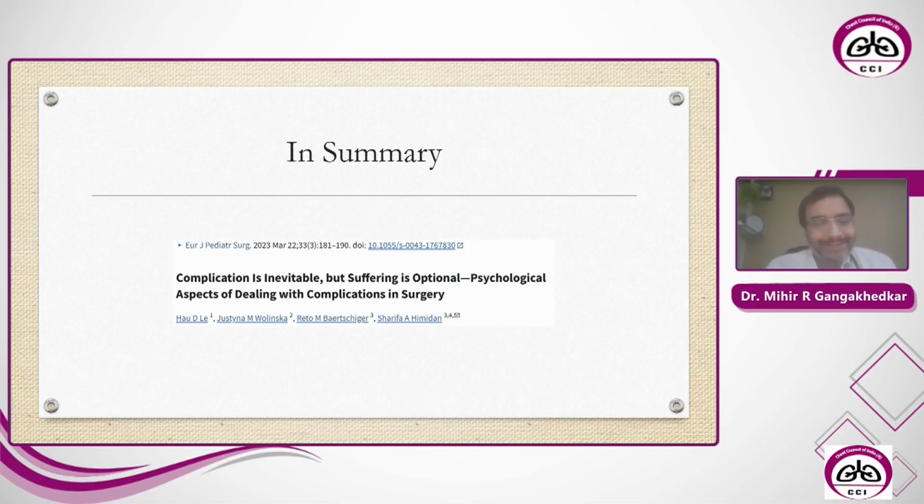And finally, scope damage, something that we're all afraid of. It's an expensive issue. Your scope gets damaged. Eventually, you are losing out on doing procedures, the cost of getting the scope repaired, whether it will get repaired or not. You feel, why has this happened to me? But even in our Indian survey that we did, 70% said scope damage was a real problem. And obviously, throughout our data sets, we find that it's more in learning curves. And if you have larger volumes, this is likely to occur.